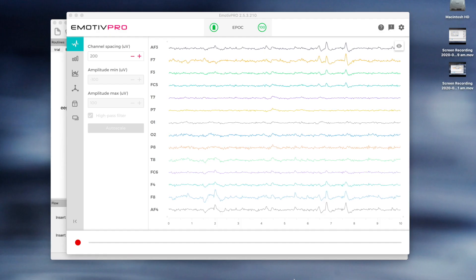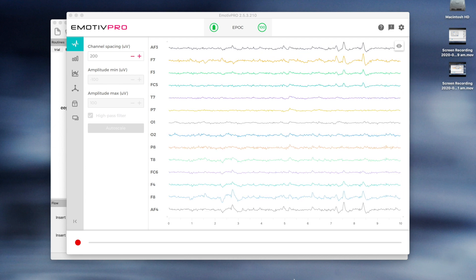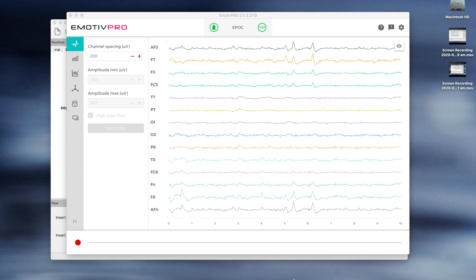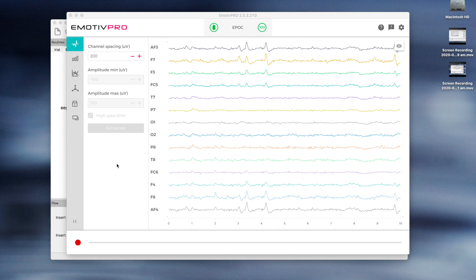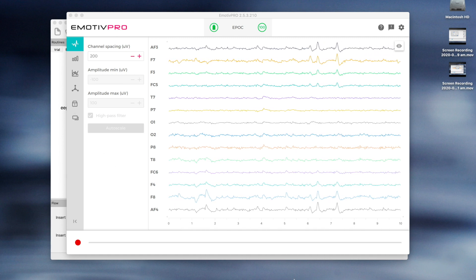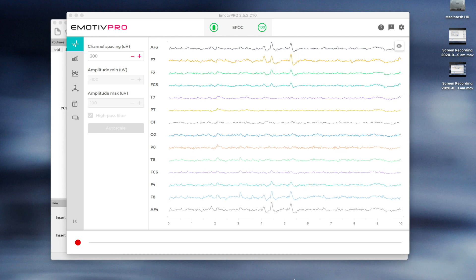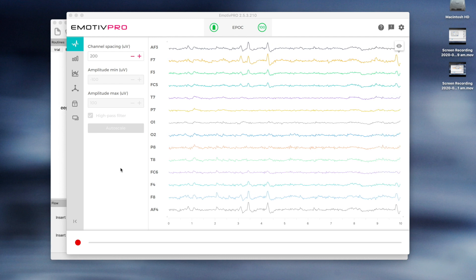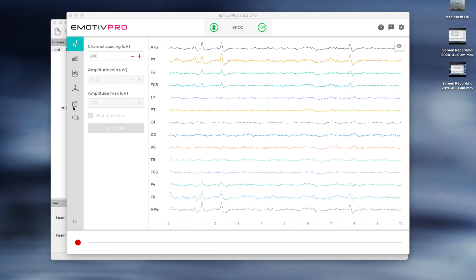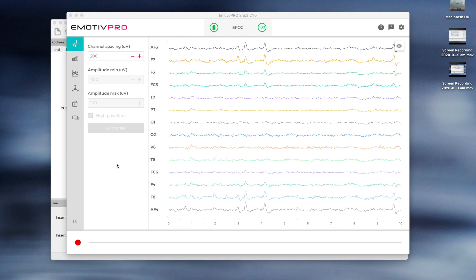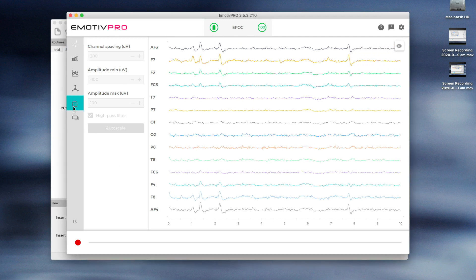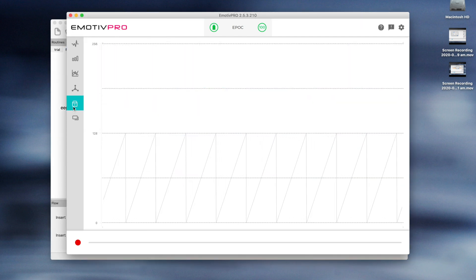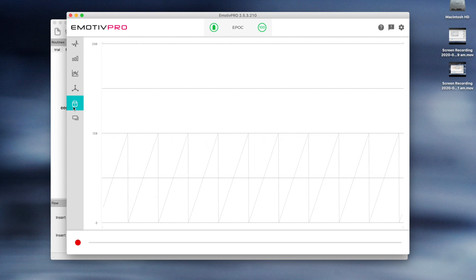To ensure that you record good quality data, it is a good idea to check the data in EMOTIV Pro. Here you can check that the contact quality is 100% and that the data looks clean. It is also a good idea to check that the wireless connection is working well by clicking on the Data Packets tab. The sawtooth pattern should be smooth and there should be no vertical red lines which indicate that samples have been lost.